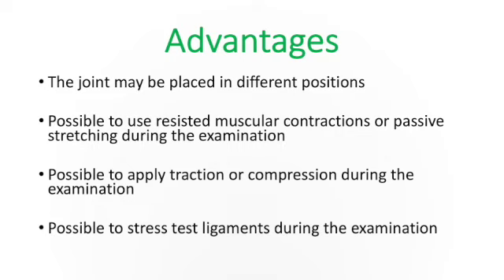As I'm going to show you in the Blackboard Collaborate session, we can actually watch muscle contract. So not only is this really nice for things like imaging or the screening for pathology, but also things like biofeedback. So our patients can get a good sense of, hey, I'm actually contracting that muscle because I can see it.